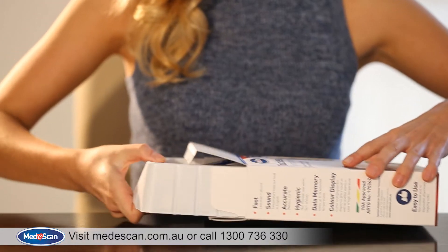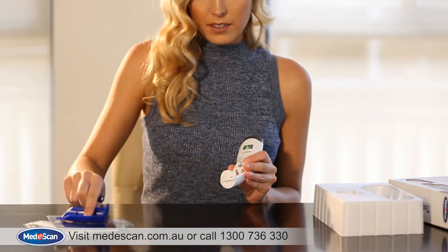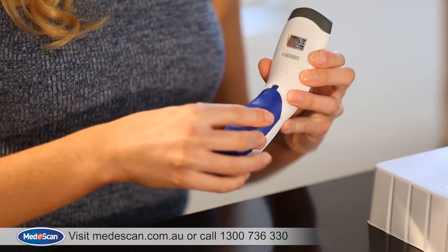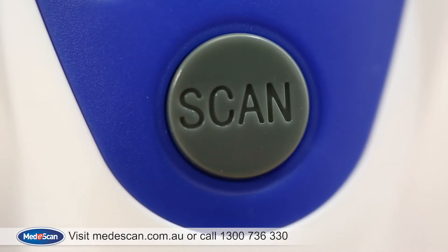First, after you've unboxed the thermometer, slide the blue handle down to install the batteries provided. Then press the Scan button to turn the thermometer on.